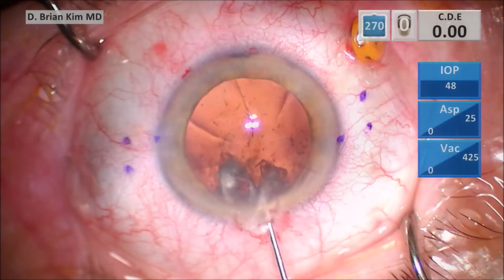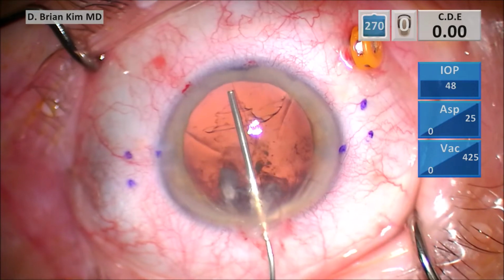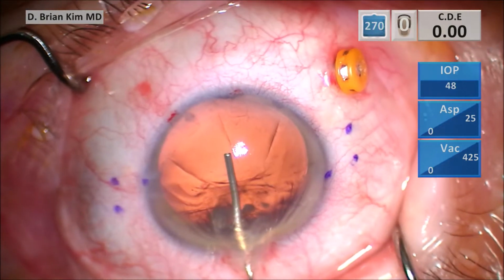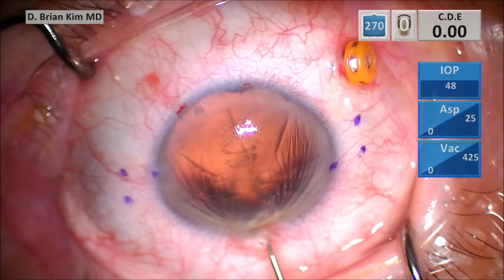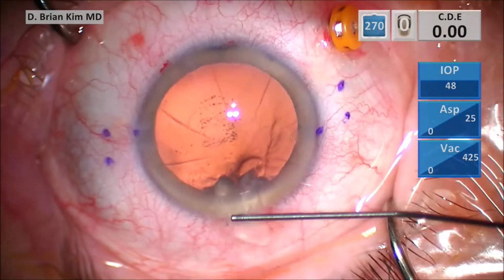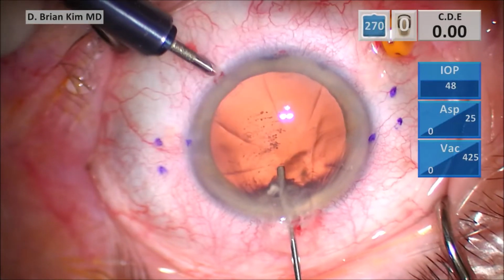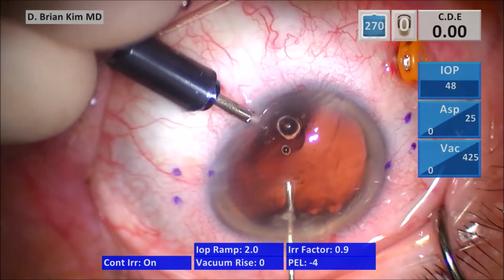So again, a fairly systematic way I attacked the removal of the dislocated lens: strategic placement of the trocar just underneath the hinge where the zonules are holding the lens, lifting it using microforceps to grab it, cutting it in a strategic manner, like I said. You saw I pushed some more dispersive viscoelastic, which helped push some of that Soemmering's ring and capsular material out of the main wound, but you really need better infusion.